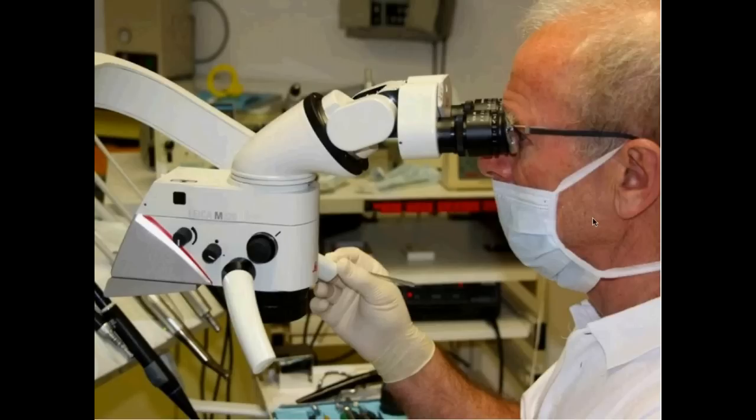Okay. How much maintenance is needed for the microscope? And what about calibration? Can you calibrate the microscope, or how do you do this? I don't quite understand what you mean by calibration. There are no measuring devices in a microscope. You just know how big the magnification is when you turn this button, and you need perhaps service every second year, every fifth year.